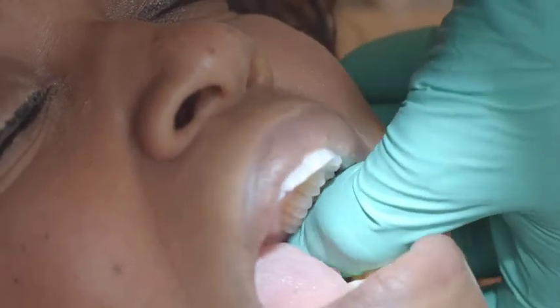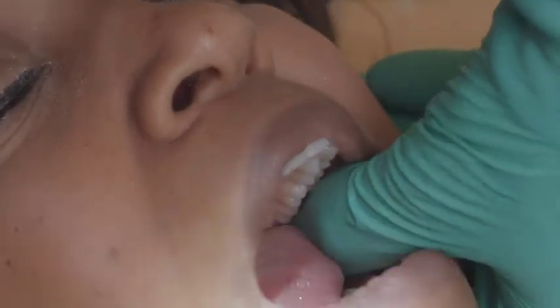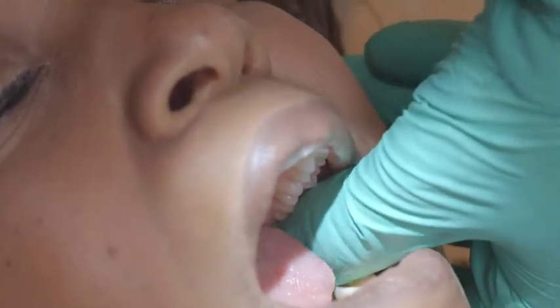Come out, open for me wide, and I rub it. One of the keys that people don't understand is that with anesthetic, you really want to rub it into place. Just get it nice and easy.